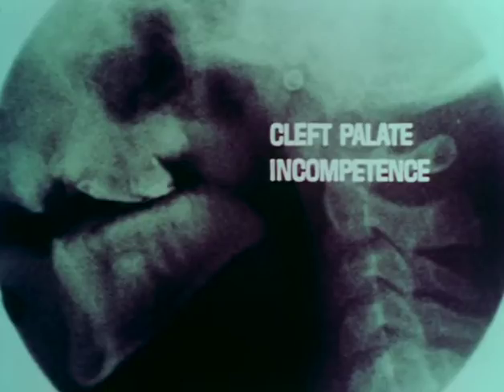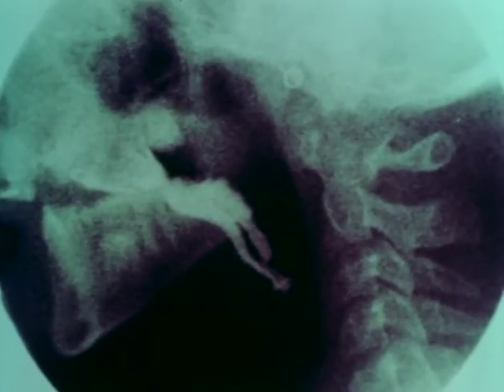Visually compare these patients born with palatal defects with the previous group, who preoperatively presented no palatal or facial anomalies. The classical cleft palate deglutition pattern is illustrated during the pharyngeal stage. The posterior base of the tongue is depressed to allow the bolus to flow into the esophagus because the residual velum is not adequate to seal the nasopharynx. This compensatory deglutition pattern is established early in life to prevent continuous nasal regurgitation. During phonation, the velopharyngeal incompetence is extreme.